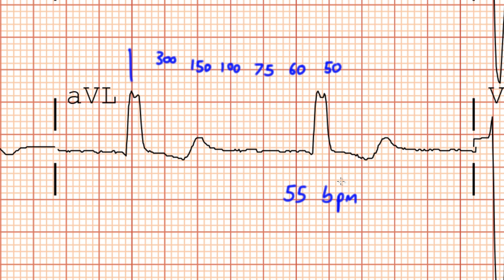If you want it to be even more precise, instead of taking the number 300 and dividing it by the number of large boxes between consecutive QRS complexes, you could take the number 1500 and divide it by the number of small boxes between consecutive QRS complexes.